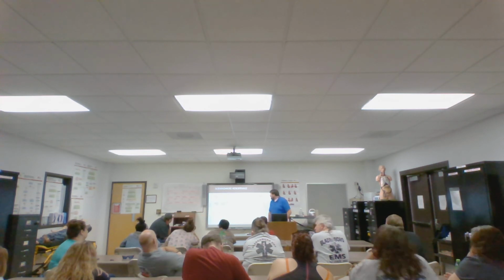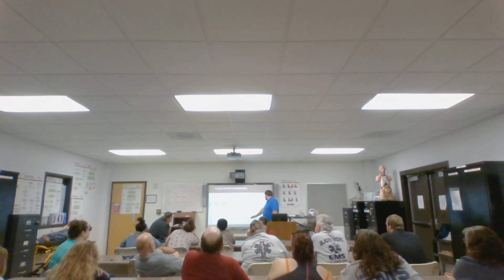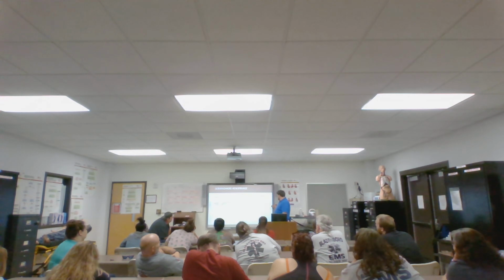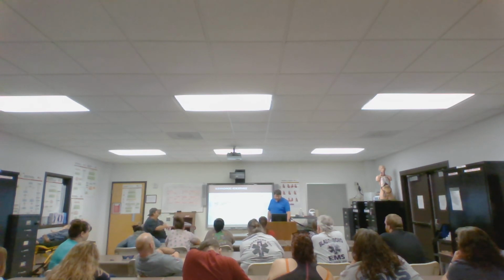So you got your normal 12 lead. I know y'all are about tired of seeing this one, but good 12 lead. And what do you got over here? Depression, and look at them T-waves. Look how wide and inverted they are. So that's a really good one to show you.